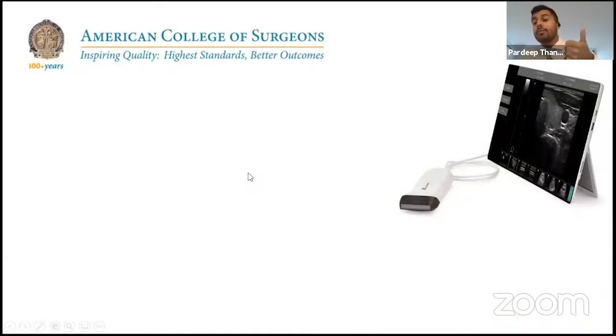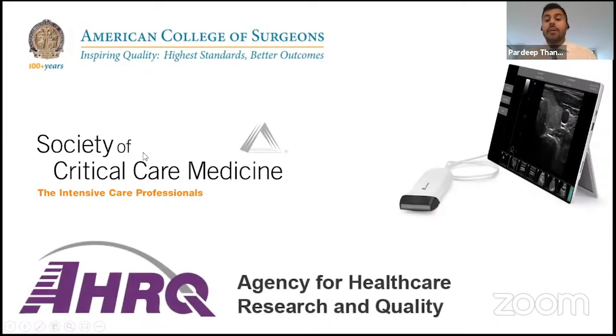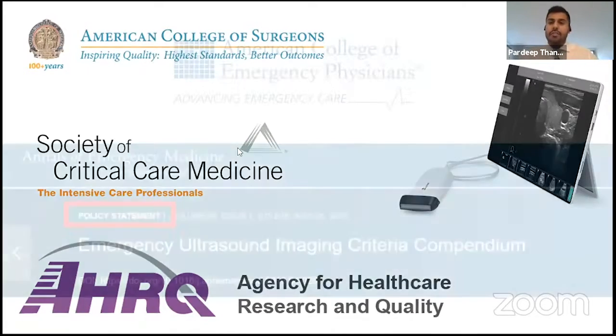The American College of Surgeons recommends the use of ultrasound for all central lines. The Society of Critical Care Medicine has a level 1 recommendation that all central lines be placed with ultrasound. And the Agency for Healthcare Research and Quality has it as one of the top 11 evidence-based measures to decrease bad outcomes and increase patient safety by using ultrasound for central lines. Okay, fair enough. These are good guidelines.